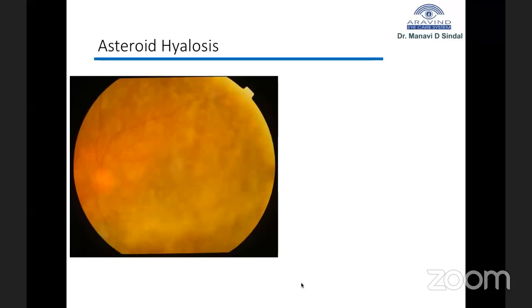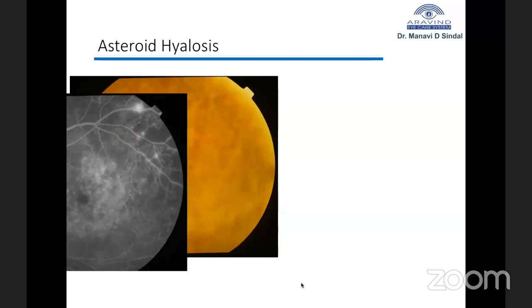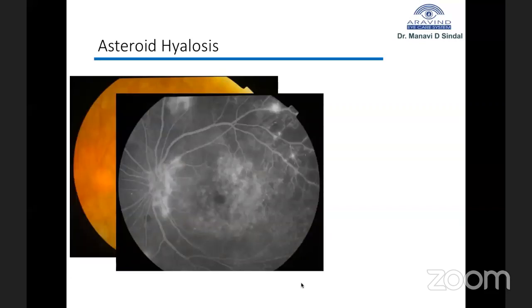And as you can see, this obviously extensive ischemia, calcium crystals which are there in presence of diabetic retinopathy, obstruct the exact staging of diabetic retinopathy in these eyes. But when you do a fundus fluorescein angiography, the small wavelength blue light easily traverses these particles of asteroid in the vitreous, and you get a fundus image, which is just like an FFA image in a normal person.